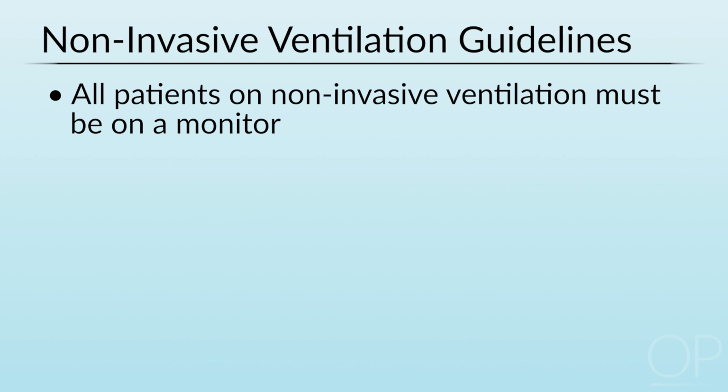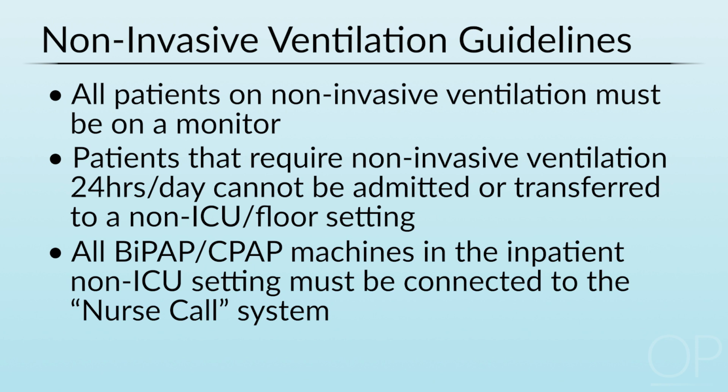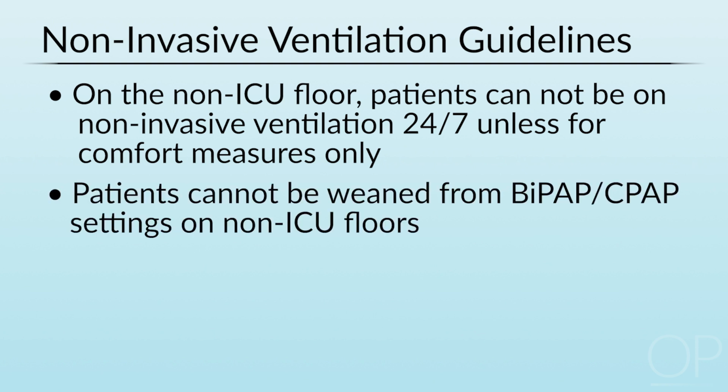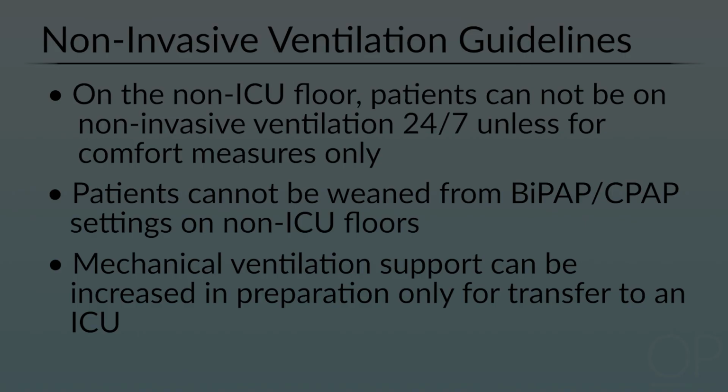All patients on non-invasive ventilation must be on a monitor. Patients that require non-invasive ventilation for 24 hours a day cannot be admitted or transferred to a non-ICU or floor setting. All machines used to deliver BiPAP or CPAP in the inpatient non-ICU setting must be connected to the nurse call system. For this reason, patients may not use their home BiPAP or CPAP machines while in the hospital. Some rules of thumb for the floor: patients cannot be on non-invasive around the clock unless it's for comfort care measures only. We cannot wean BiPAP or CPAP settings on the floors, and the only time you can increase support is in preparation for transfer to an ICU.